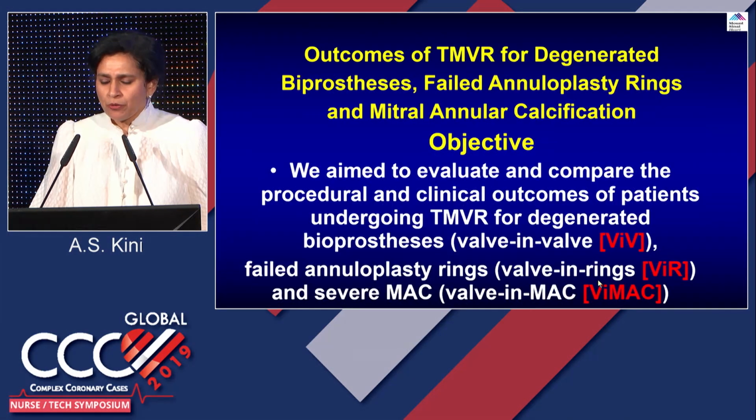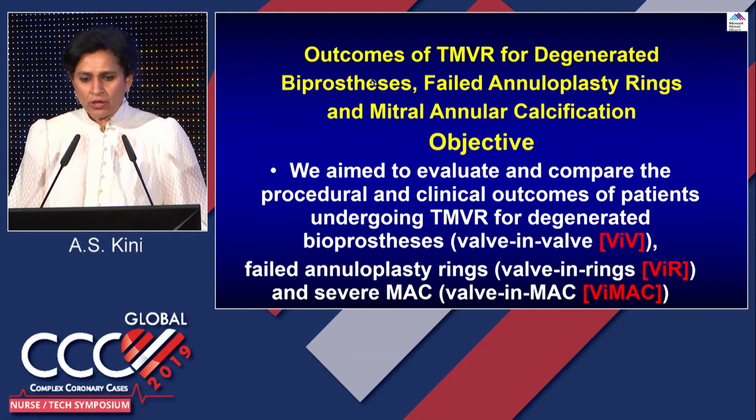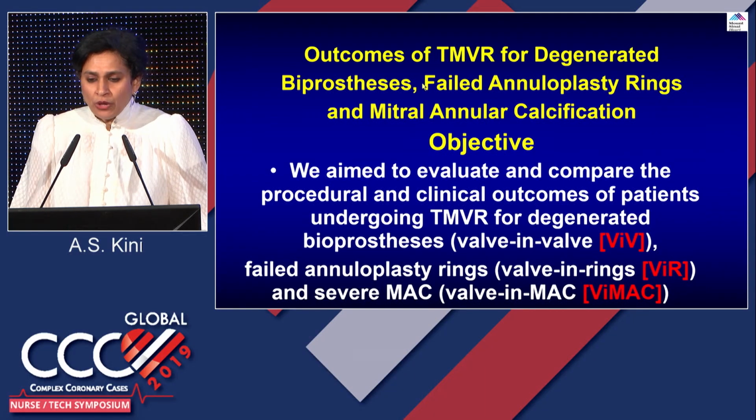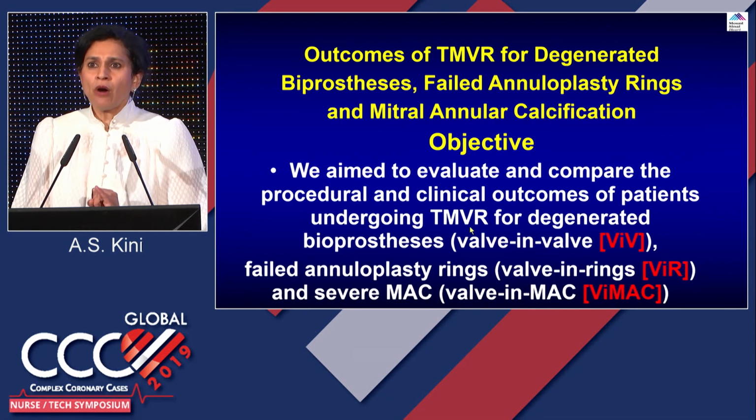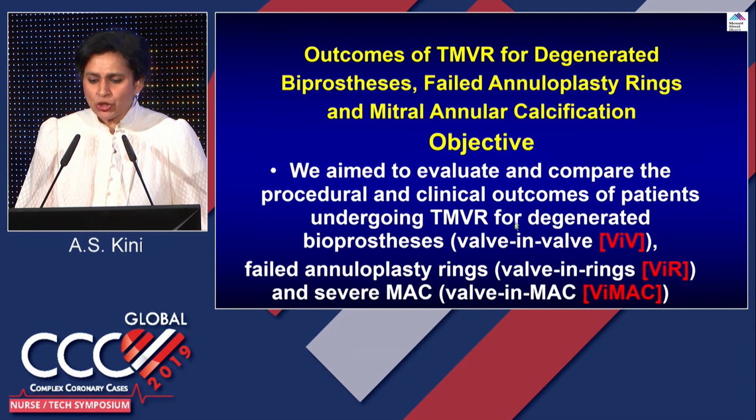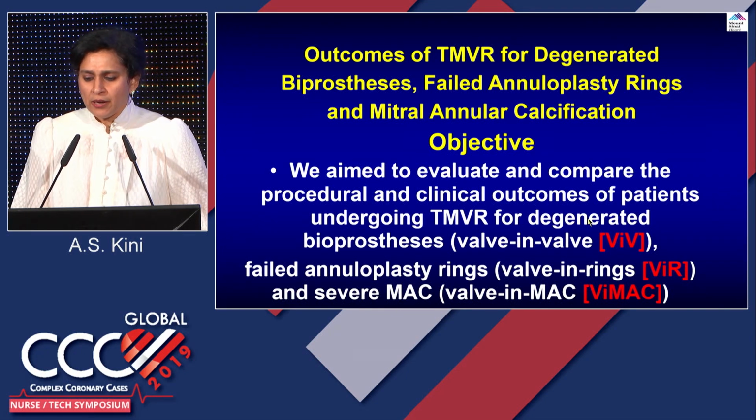It's ongoing, very poor enrollment, but working on it. So what we can do, or what people have tried, is that if there is a previous mitral prosthetic valve, can we do something? So how is the mitral valve being treated? Either they're getting a repair, they're getting a ring, or they're getting replaced by a prosthetic valve. So for these particular patients, can we place a valve?